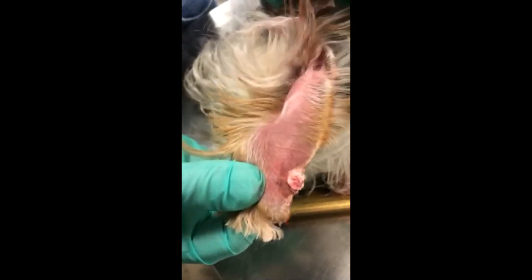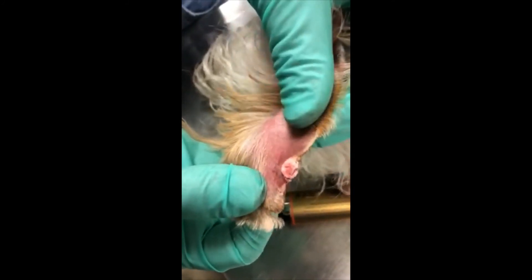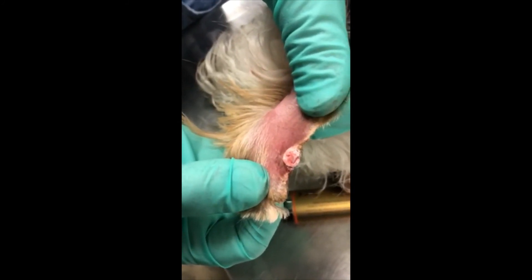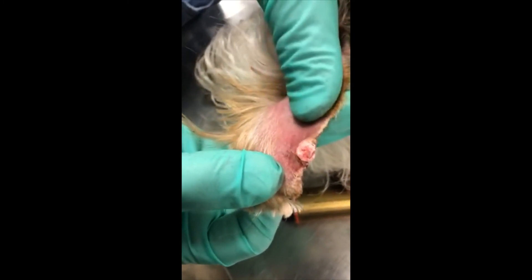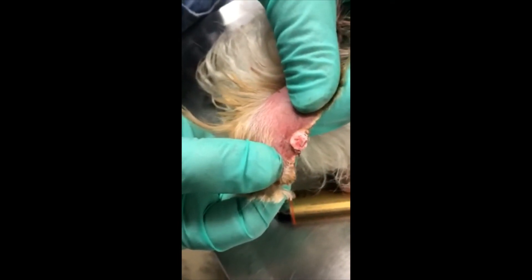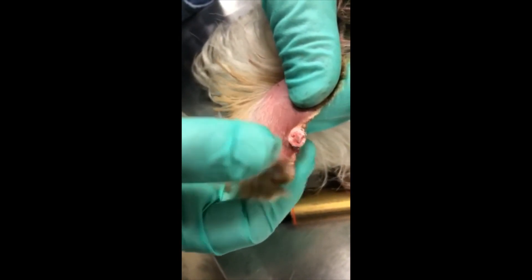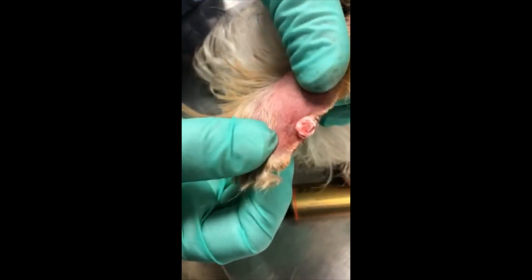I've trimmed off some of the long hair so that during the necrosis cycle we don't get adhesion of hair on top of the mass. We'll see him in three weeks, and if it's completely gone, in this particular ear there will be a defect in the pinna margin, but it shouldn't be unsightly once the hair's grown back in.